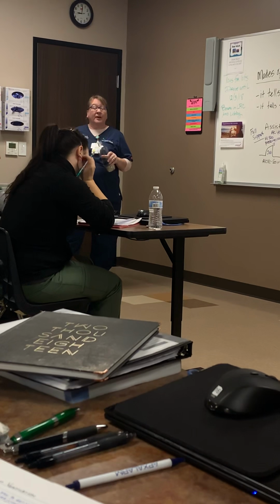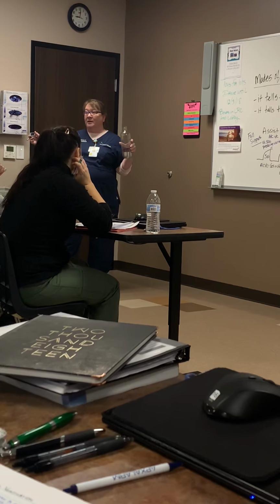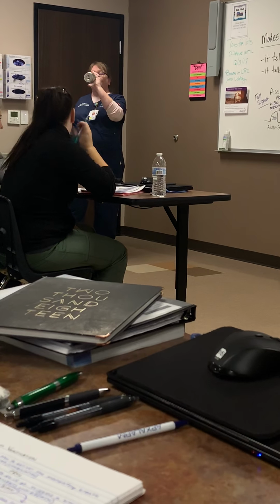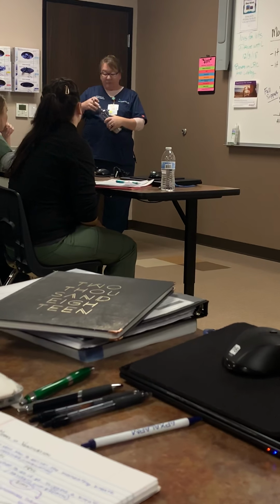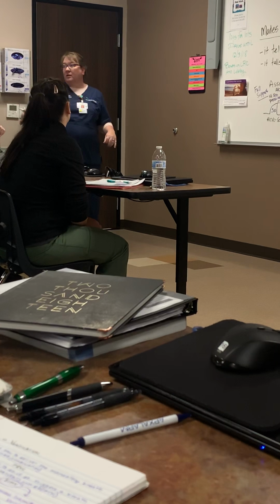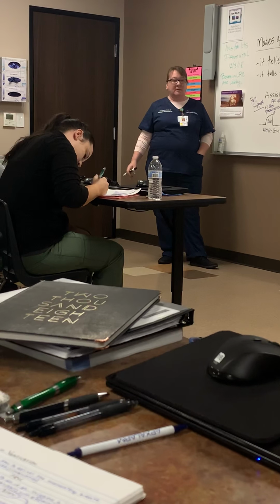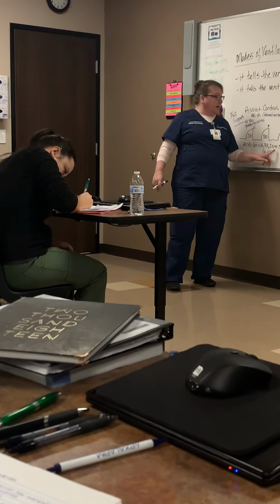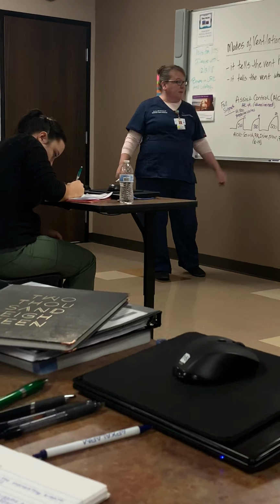And what's our starting tidal volume range? 5 to 8 mLs per kilogram of ideal body weight. In assisted control, what would be a reason to go low or high on rate? We go higher for head traumas, which we'll talk about later, and lower maybe for asthma patients, because they really have trouble on the vents. We've already talked about normal I-time, normal flow, and normal flow pattern is decelerating. So everything's the same for SIMV.